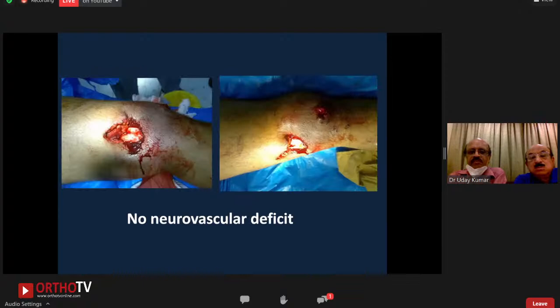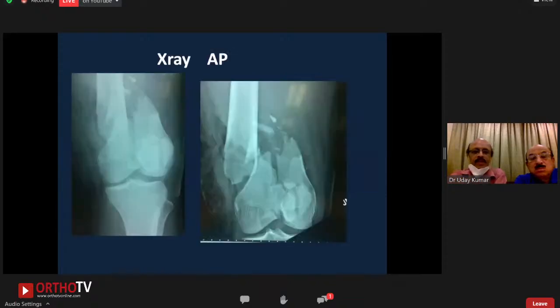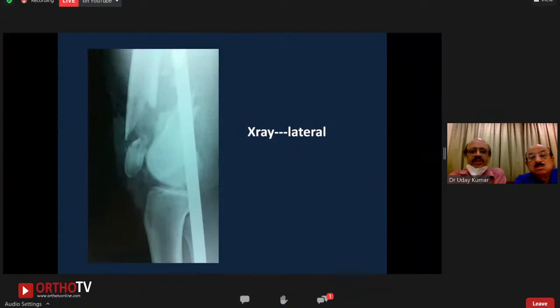This was the injury, a compound fracture of the distal thigh with the medial bone projecting out. Luckily, he had no neurovascular deficit. Now, this was the X-ray at that time, grade 3. This is the AP view, and this is the lateral view. The superior pole of the patella fractured in this area.